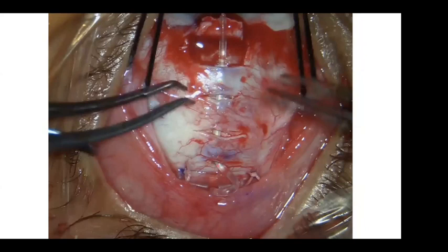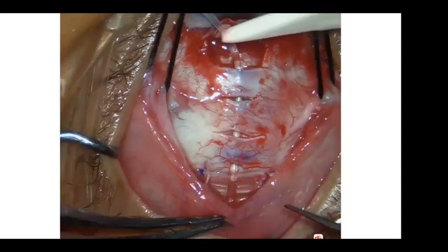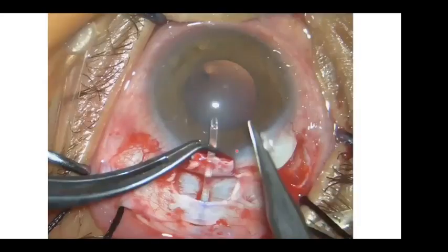So it looks like a long tunnel, but I cannot dissect a tunnel that is 9 millimeter with the crescent. That's very dangerous. So I'm just dividing, and those spaces sometimes disappear completely. So it seems like one tunnel, like here, so that it looks like a tunnel.